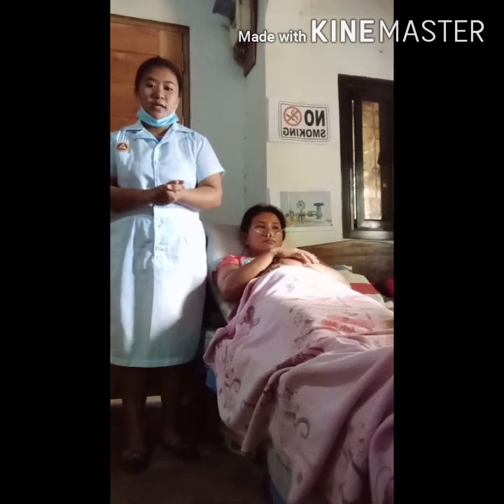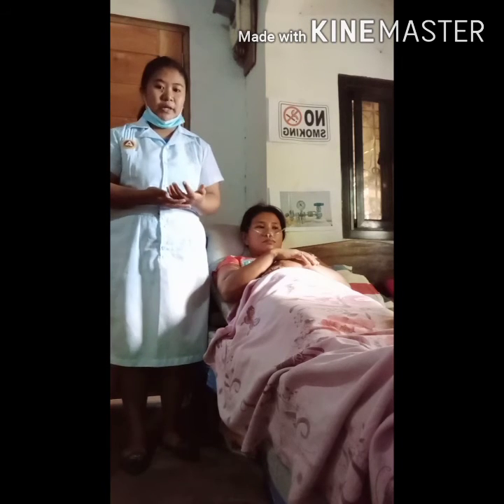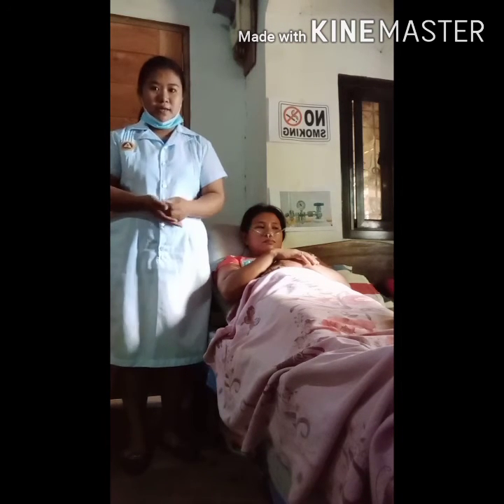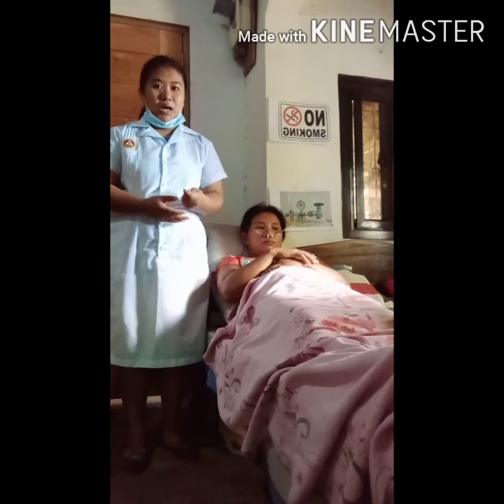And then next is the evaluation: assess for the proper functioning of equipment and observe the client's initial response to the therapy, and then monitor the oxygen therapy by assessing for the pressure. And then next is perform the follow-up based on the findings that deviated from the expected or normal findings, and then identify the unexpected outcomes.